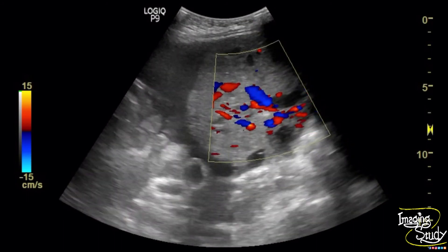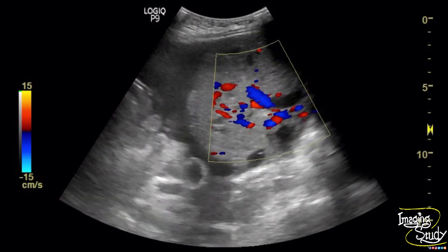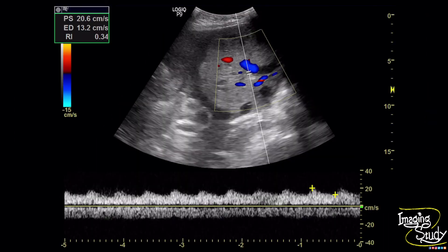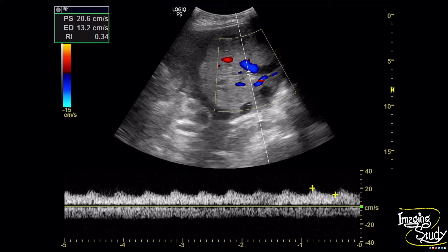Now let's check the spectral Doppler measurements. The spectral Doppler shows the prominent artery is of ovarian origin because the wave pattern shows good diastolic flow without any early diastolic notch, which is present at the uterine branch. The resistive index is 0.34. We know that if an adnexal mass has an RI less than 0.4, it indicates the mass is possibly of malignant nature. This is causing confusion because a dermoid should not show this amount of vascularity — so possibly this lesion is undergoing malignant transformation.